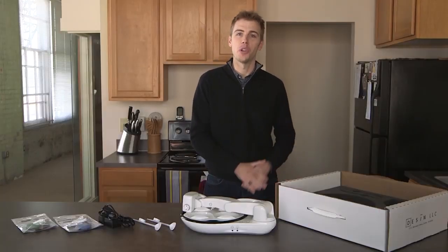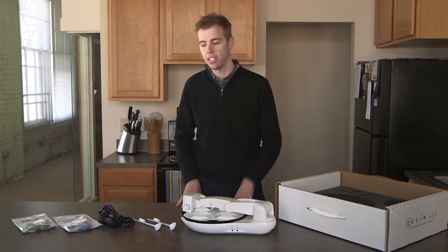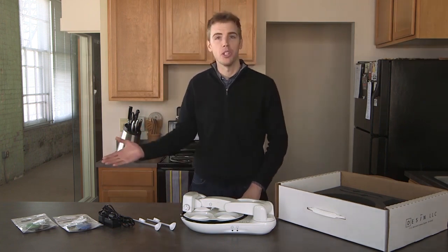As you continue unpacking, you'll notice the following contents: an OB complete with a plate and placemat, two spoons, a charge cable, and if also ordered, accessibility switches.